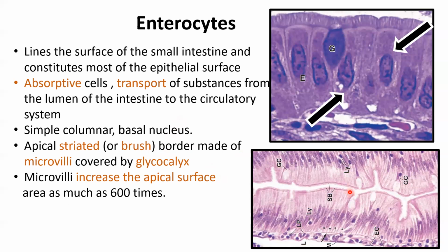So here is a high magnification. This again is just to give you orientation. This is a brush border. These are the columnar cells. The enterocytes are here. Some of those are just labeled as lymphocytes. Again, all these labels should be in the notes for this slide.